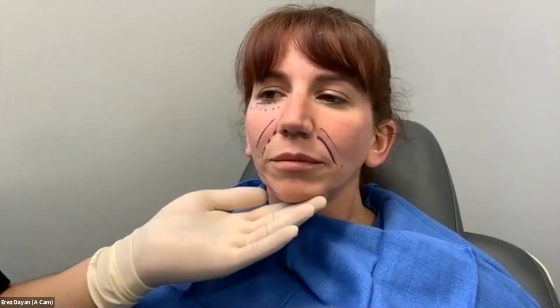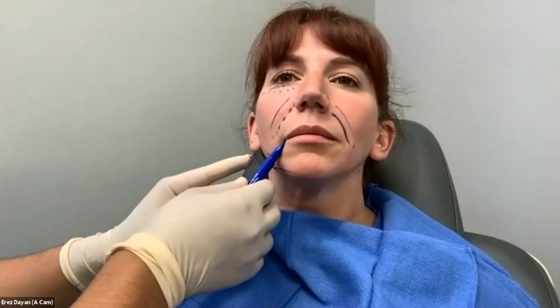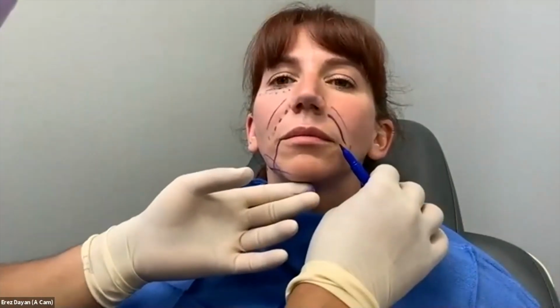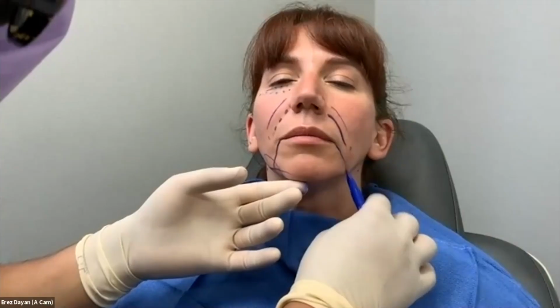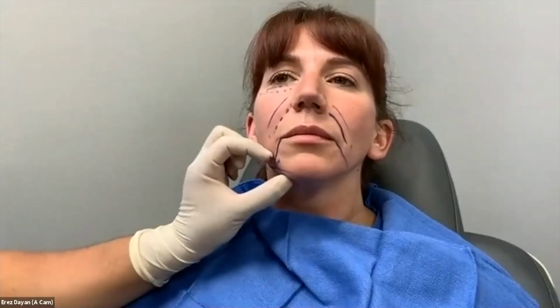Now the only danger zone here is the marionette line. We just come down, follow the marionette line. So I like to cheat it out a little bit. It just keeps me a little bit safer. So let's say her marionette line is like that. Where these two lines collide is what I want to avoid. And I draw a pretty generous X there just to remind myself this is a no-fly zone.